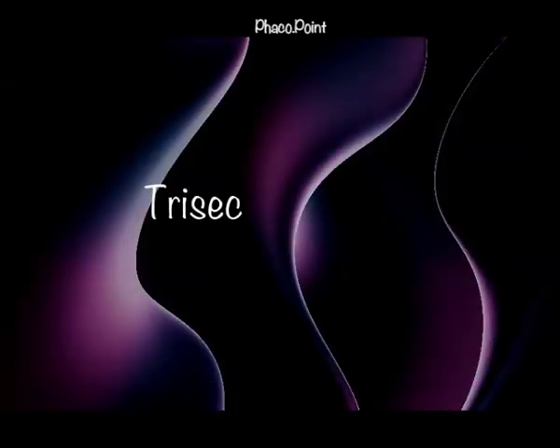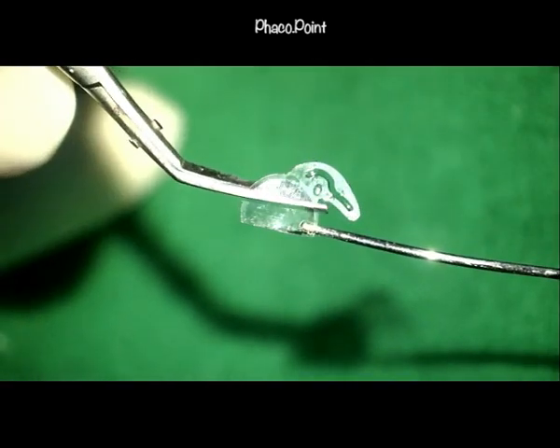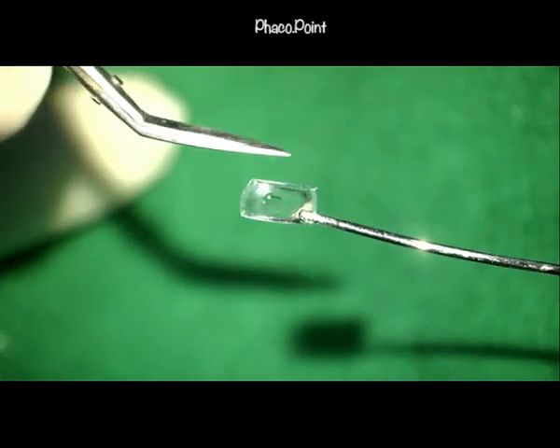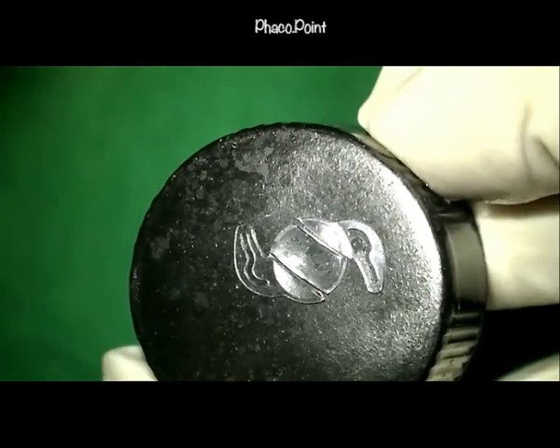Sometimes when removing these cut IOLs, we end up with significant wound distortion. Here is a way to achieve two things: smaller fragment sizes to prevent wound damage, and avoiding the need to cut through the thick central part of the IOL. The optic can be cut into three pieces instead of two — a first cut, then a second cut — leaving three smaller pieces of IOL which can be removed from the eye with significant ease without damaging the incision.